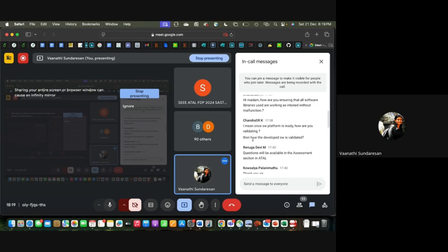So, what we do is that we have multiple data sets that are available for validation, which we do not use for the model development process. And we also do extensive clinical trials and testing before the tool can be integrated into the software platform, because failing to do so will not provide good results on multiple domains. So that is something that we take seriously, and we also do extensive analysis and validation before integrating it into a clinical tool. And also tools like FSL, where my tool has been aggregated in the Oxford domain.